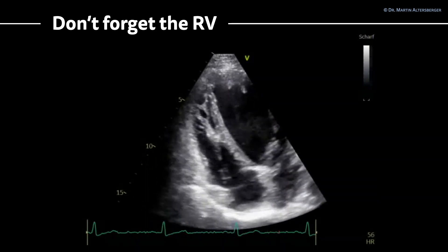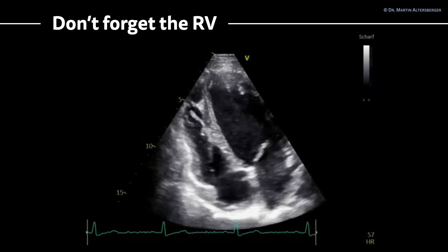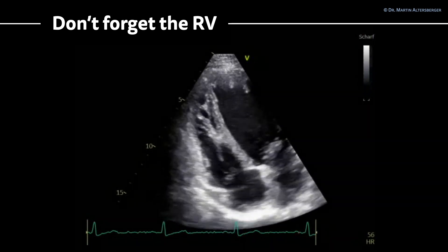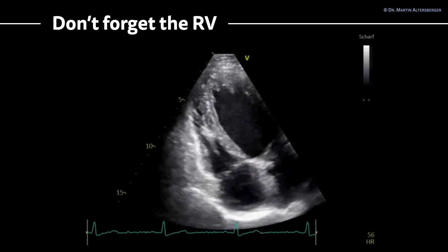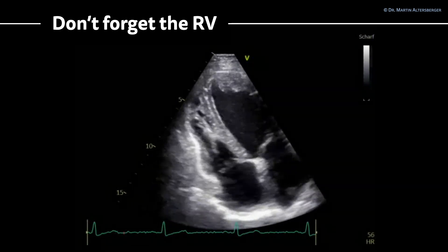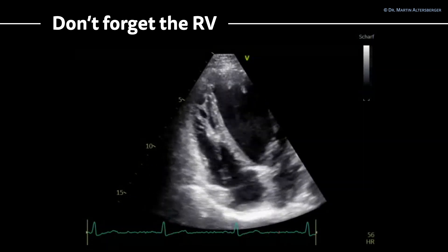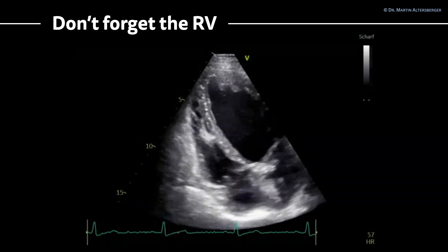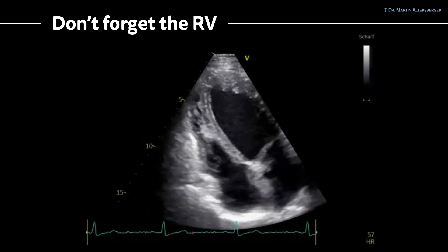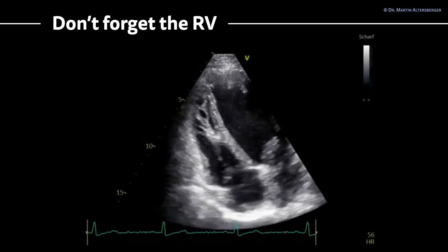Never forget the right ventricle — in so many diseases it is a prognostic factor. When we visually assess the right ventricle of this patient, we also see trabeculation, indicating right ventricular involvement. The basal region looks normal — TAPSE and S-prime values will likely be normal — but the mid-ventricular and apical regions appear reduced, suggesting moderately reduced longitudinal right ventricular function overall.